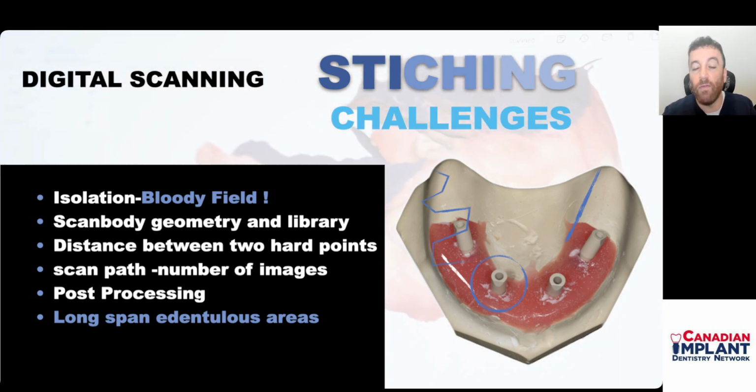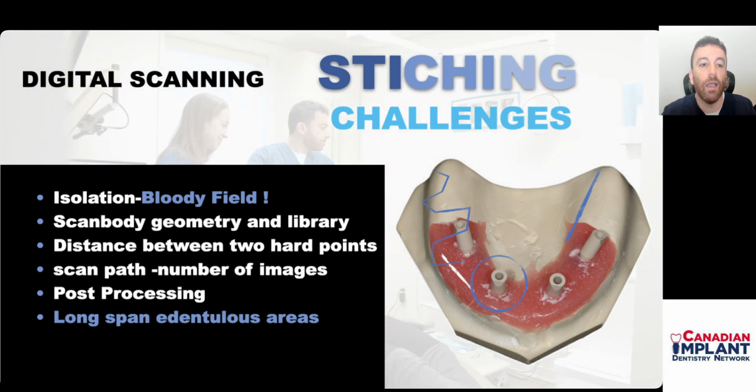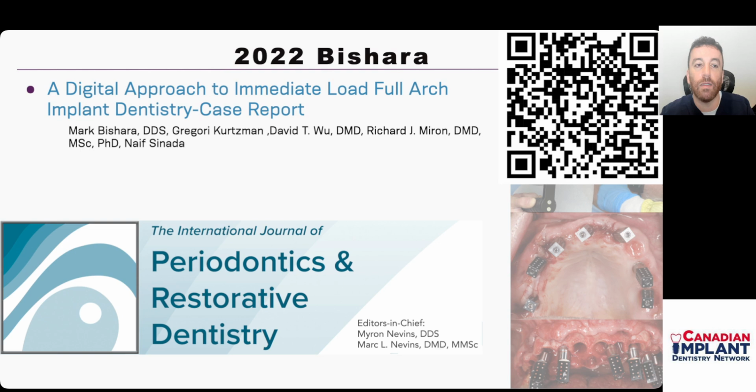Your temporary might fit because it can flex into place, but your zirconia could end up fracturing, and I've seen it happen in clinical practice. So in 2022, I wrote about a digital approach to loading of your cases, and this is again available on our website.